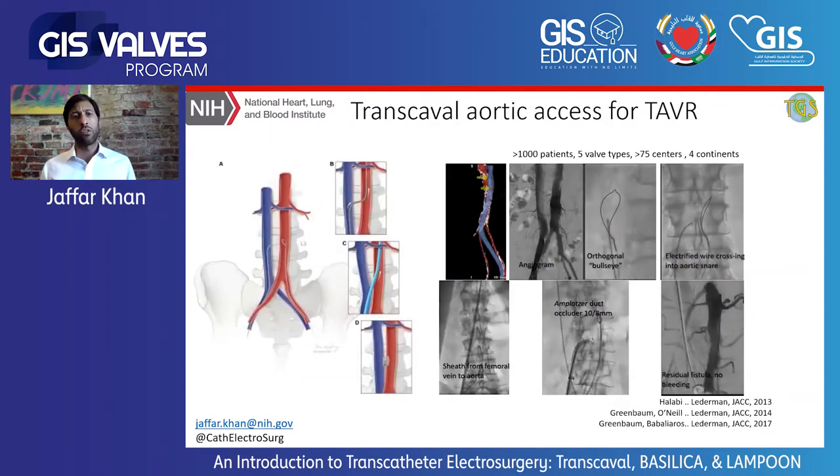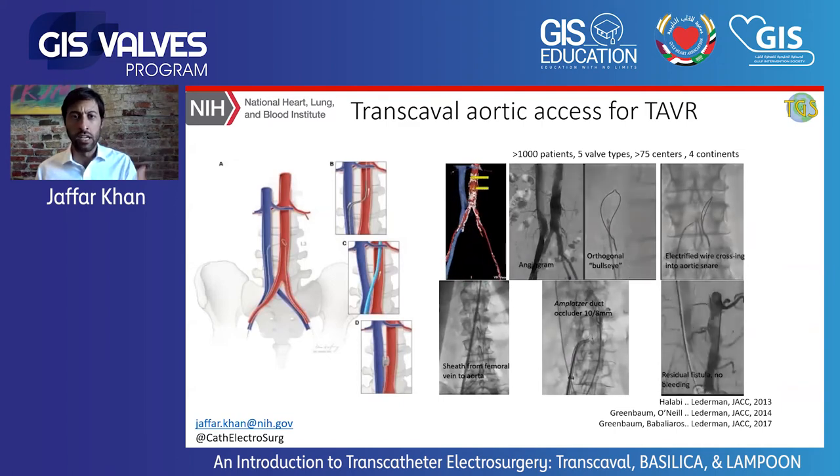I'm going to talk about three main applications of this technology. First, transcaval, then BASILICA, then LAMPOON. So transcaval access, this is where the story began. Transcaval allows large bore arterial access when transfemoral access is not possible.